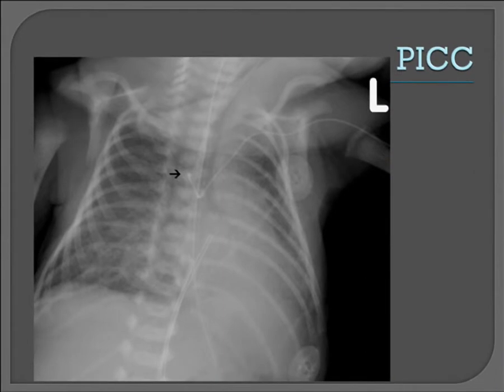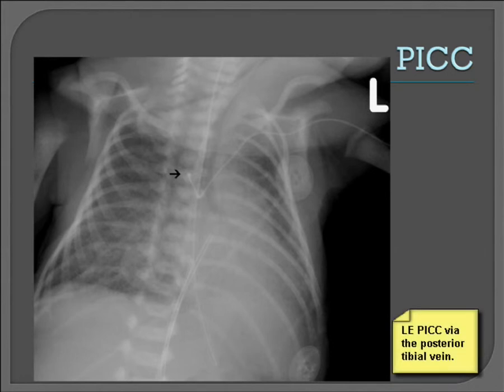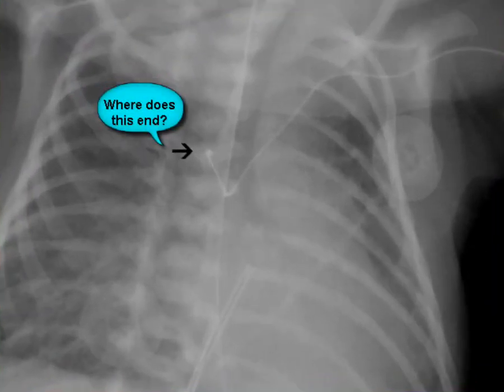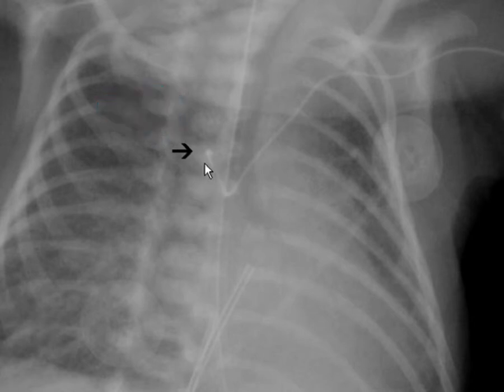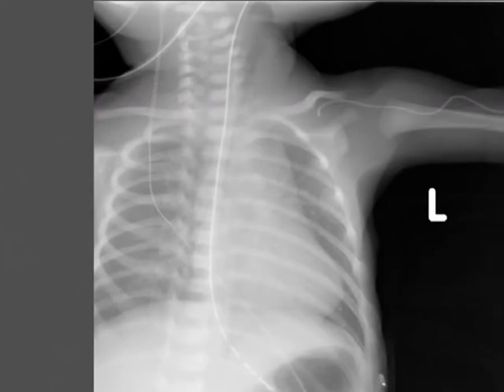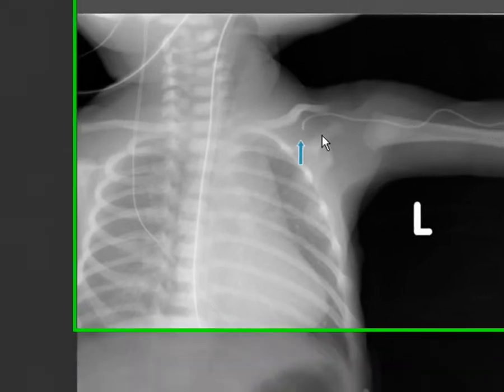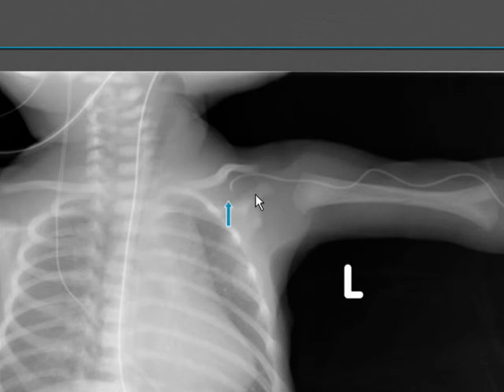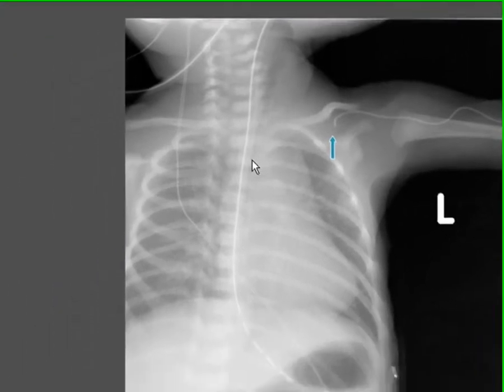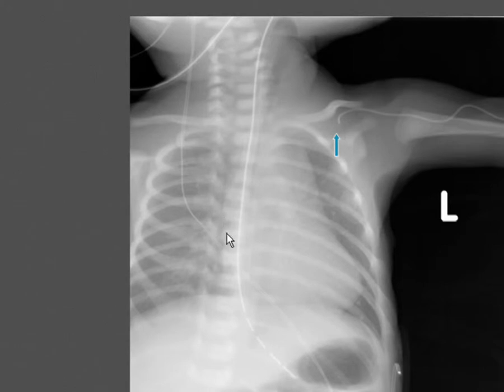Now we'll talk about PICCs. There can be upper extremity PICCs, but also lower extremity PICCs. If you see an infradiaphragmatic catheter that you may think is a femoral line — since the bottom of the film is often cut off — keep in mind it could be a lower extremity PICC placed via the posterior tibial vein. Here's an example of a malpositioned PICC coursing into the azygous. Another PICC from the left upper extremity terminates too high. The expected course goes from an upper extremity vein into the axillary vein, then the subclavian, the left brachiocephalic, into the SVC to the atrial-caval junction, terminating somewhere around there. But here it's terminating way too high.